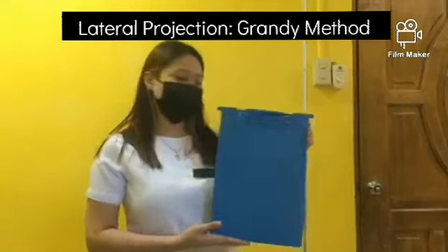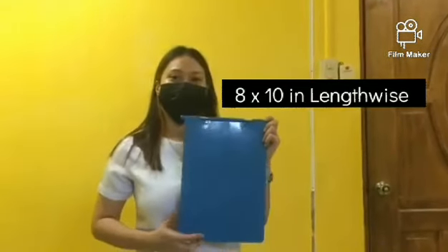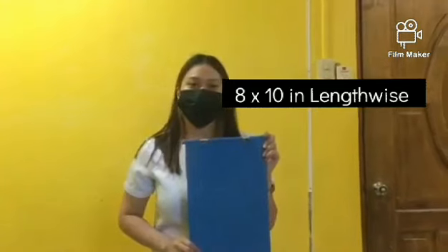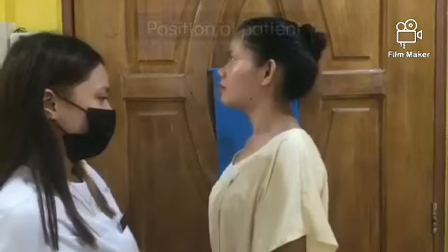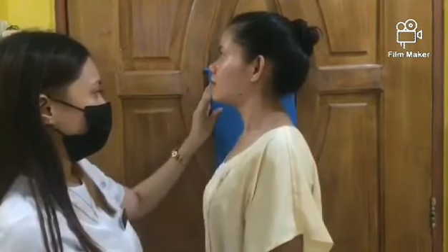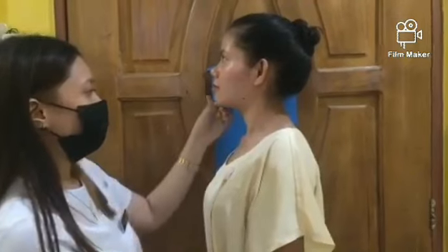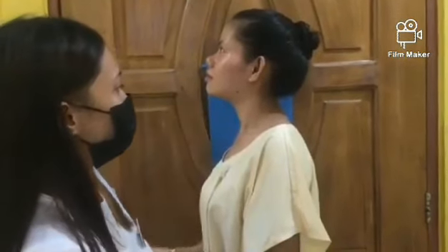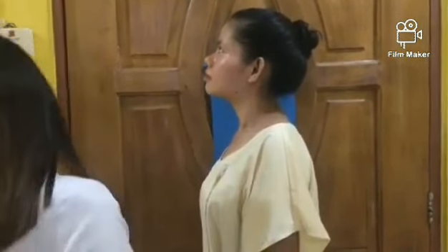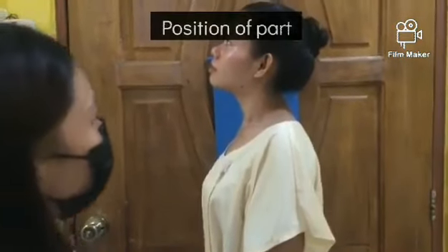vertebrae. For the lateral projection Grandy method, we're still going to use 8 by 10 inches or 18 by 24 centimeter lengthwise image receptor. For the patient's positioning, place the patient in a lateral position, either seated or standing, before a vertical grid device. So have the patient stand straight and adjust the height of the cassette so that it is centered at the level of the fourth cervical segment.